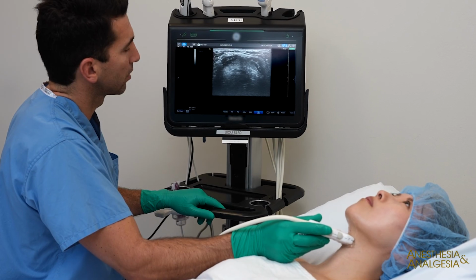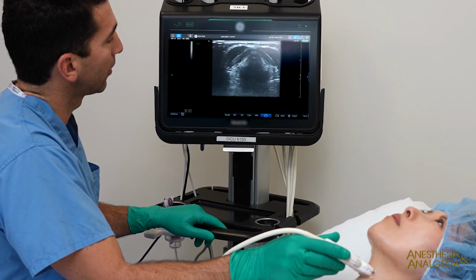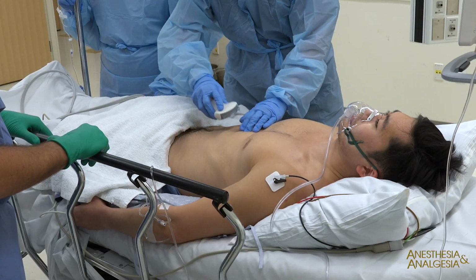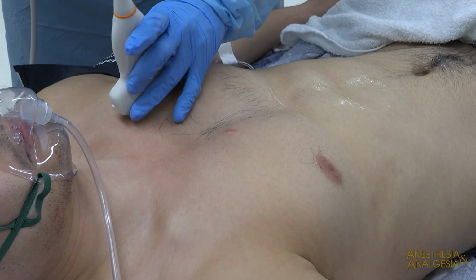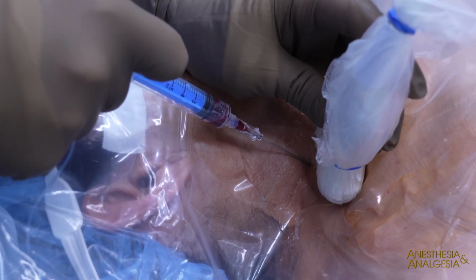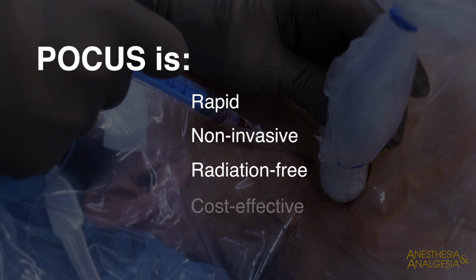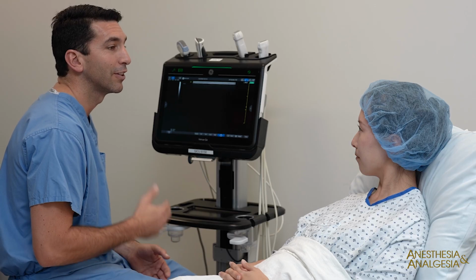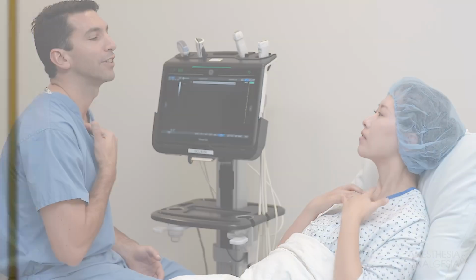The role of point-of-care ultrasound, or POCUS, in evaluating patients continues to rapidly evolve. POCUS is now used to support the physical examination, quickly assess for pathology in many anatomic locations, and guide therapeutic invasive procedures. POCUS is rapid, non-invasive, radiation-free, and cost-effective. This video describes how to use POCUS for evaluation and management of the airway.